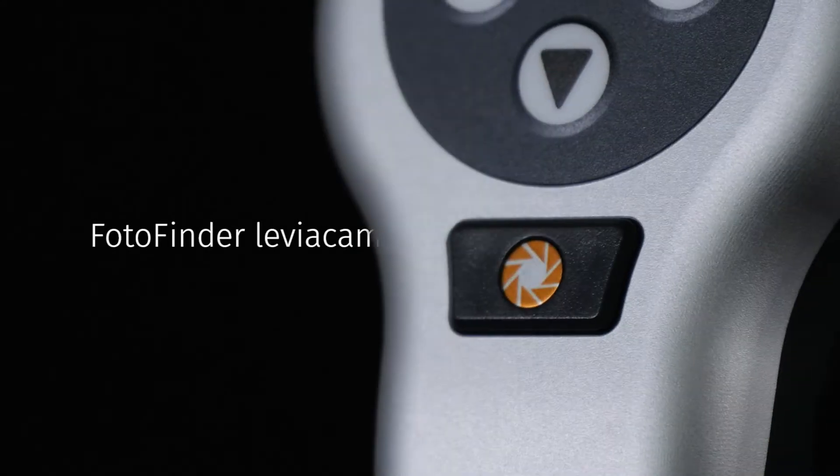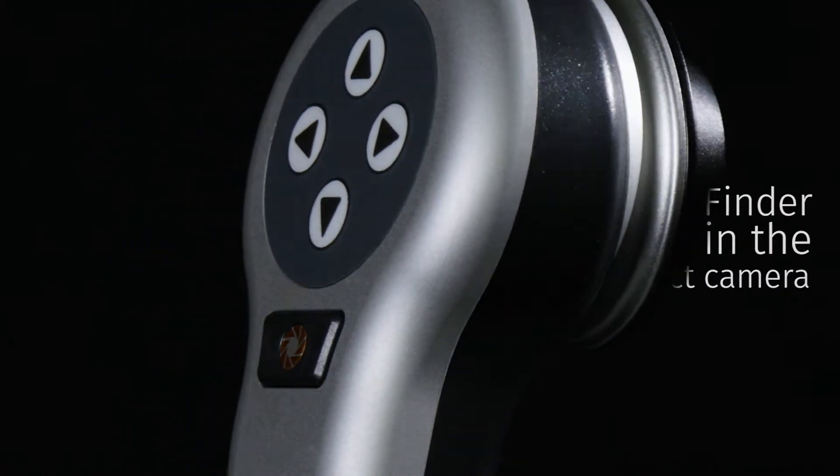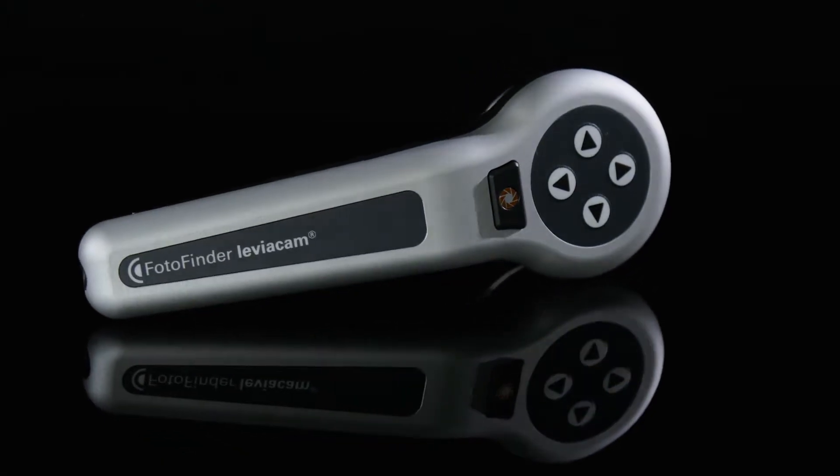We believe that simplicity is reached when there's nothing left to take away. With Leviacam we wanted to deliver a full-size photo finder experience in the most compact camera, and we succeeded.